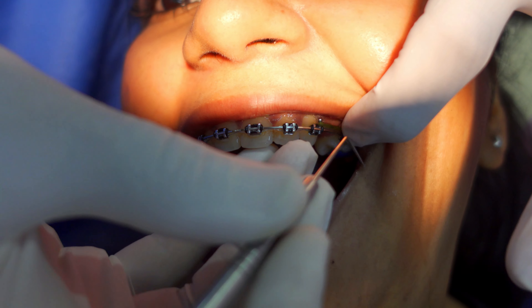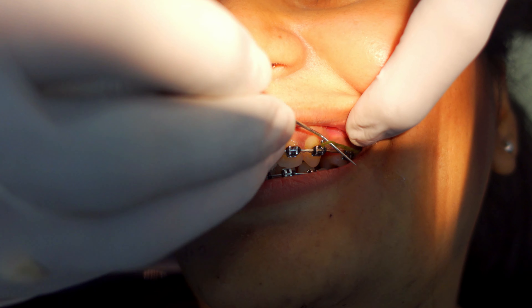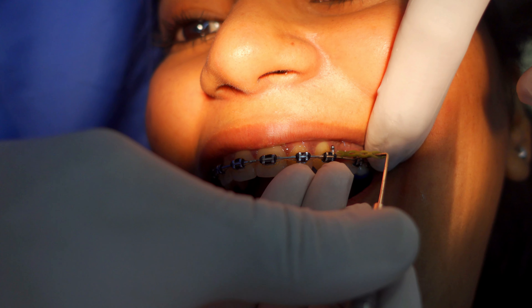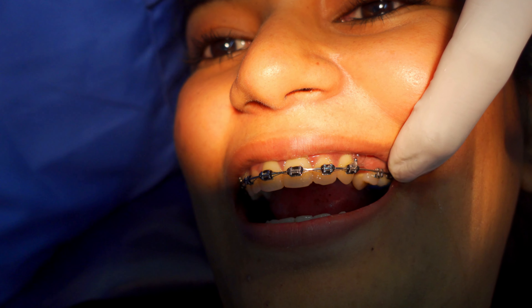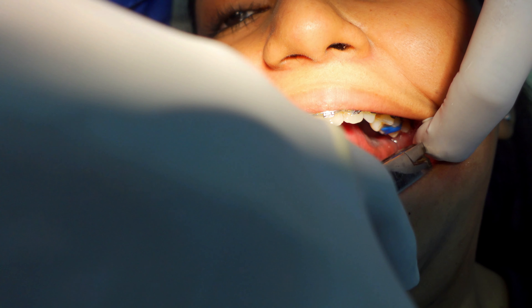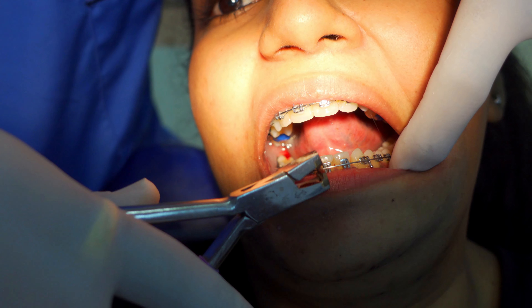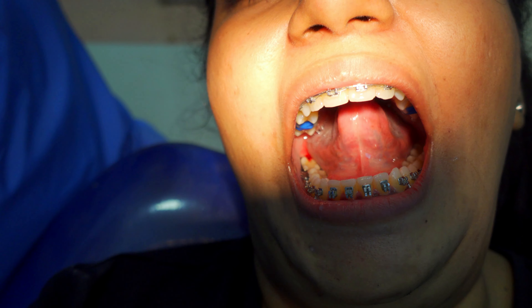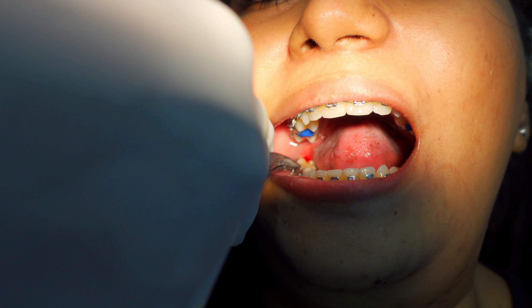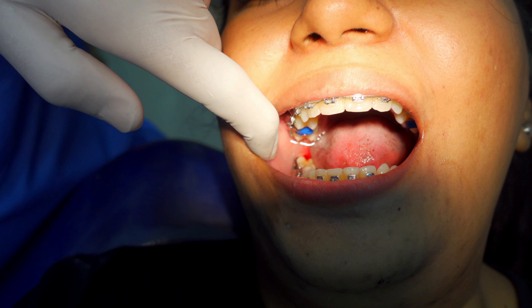And that's when he told me he will proceed with the other process — that he will change my wires and the rubber bands. While doing this, I noticed that my rubber bands were not discolored, so in case you want, you can go for the same color for yourself. This time I chose hot pink rubber bands. Also, because he was putting molar bands, they didn't fix my lower braces. In fact, they thinned the lower wire.